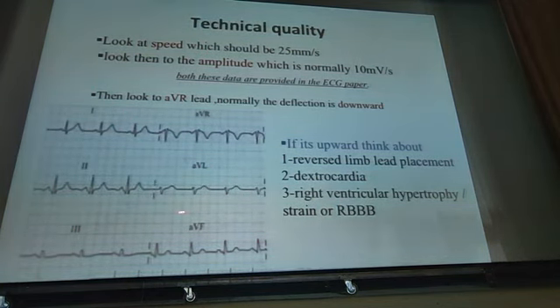How do we know the ECG voltage is okay? Sometimes you need to increase the voltage. Sometimes there is an abnormality that gives lower voltage. That's why there are options inside the ECG machine to increase or decrease this. How do you know if the voltage is normal or not? In standardization, it should be two large squares, which is 10 millimeters, equal to 1 millivolt.